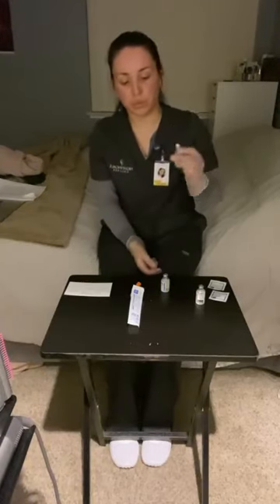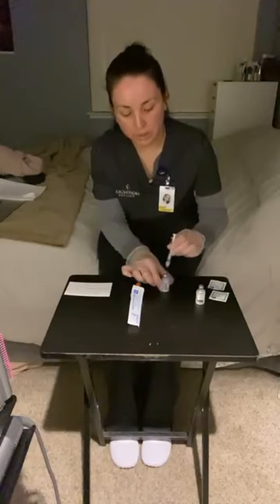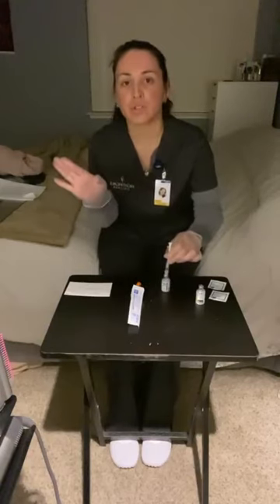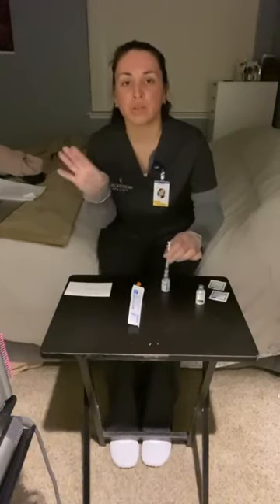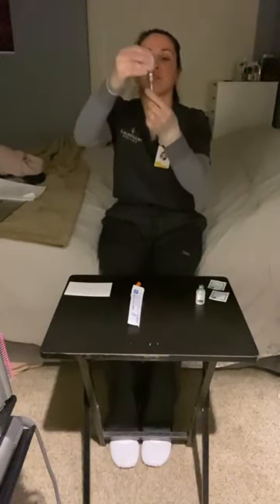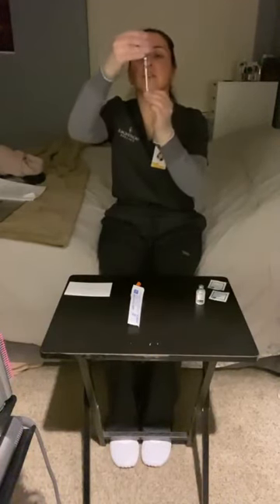I'm now going to place the needle back into the intermediate vial. Check the MAR EHR to make sure we got the total of 12 units again. And now we're going to fill it to the 12 units.